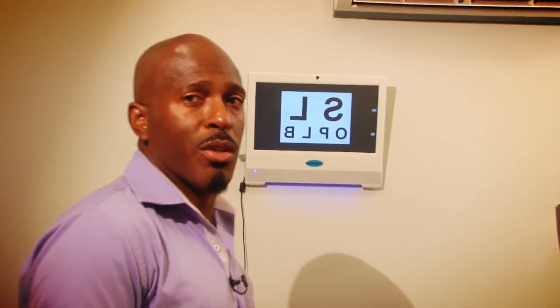And the eye pressure, or intraocular pressure, is commonly known as a glaucoma test. If the pressure in the eye is elevated, then the dilation may also be a risky activity to conduct with the patient. So we need to know this. So the patient sits in the chair, has a visual acuity test done on a chart similar to the one projected on the screen, and so we can determine what the vision level is.